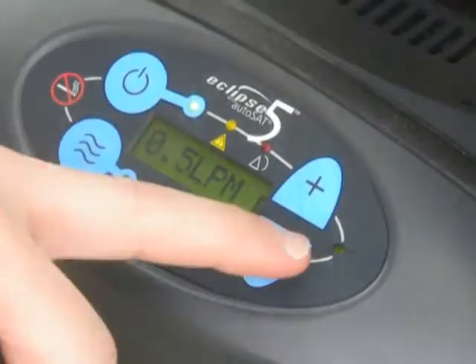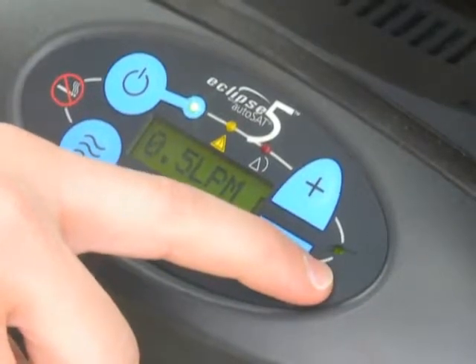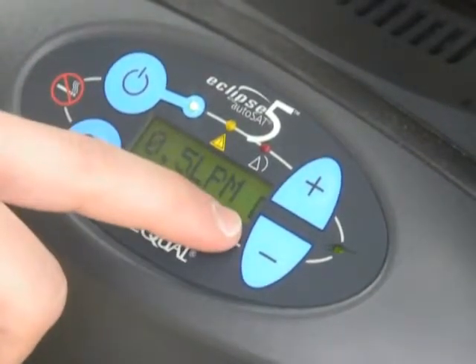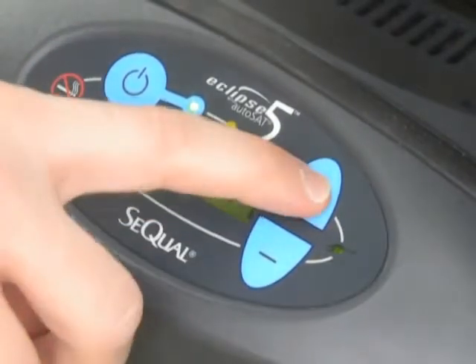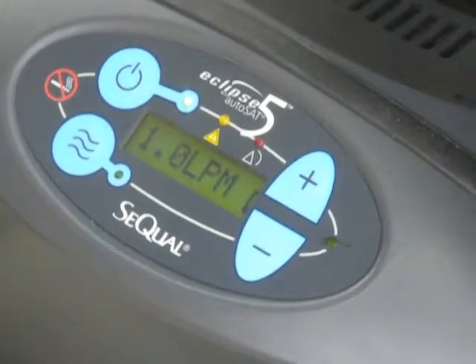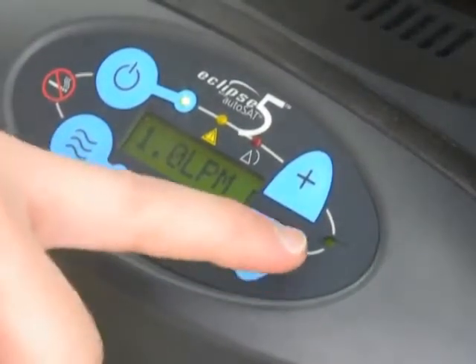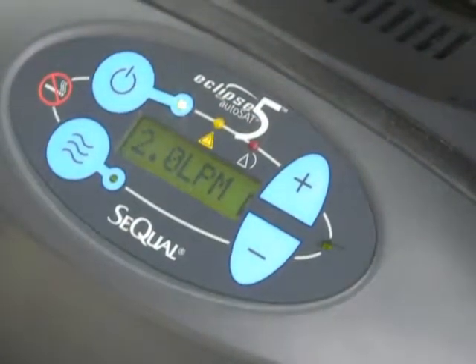Here's a close-up of the screen of the Eclipse running on DC power. Note the green electrical cord light next to the plus and minus button is lit up, showing that we're drawing power from the DC external outlet. And also note there that the battery icon is cascading. We're charging at the flow rate of 0.5 and 1.0 liters per minute. The battery will charge at all flow rates 2 liters per minute or less, assuming that there is enough excess power left over from the DC outlet.